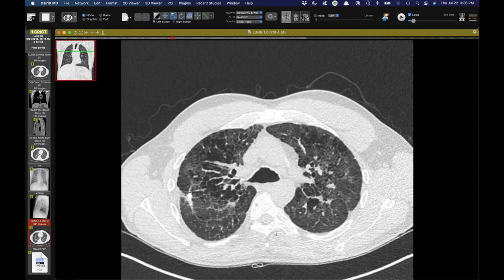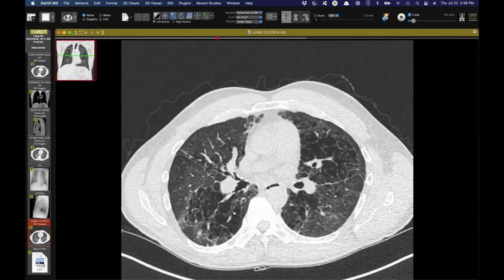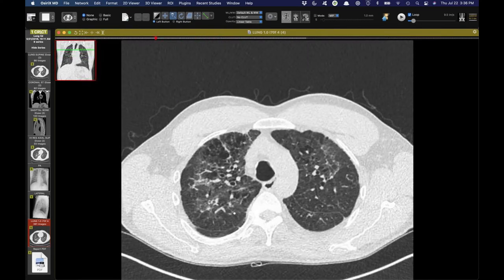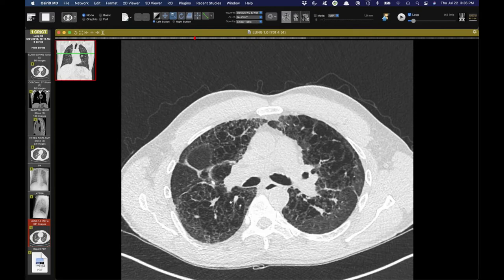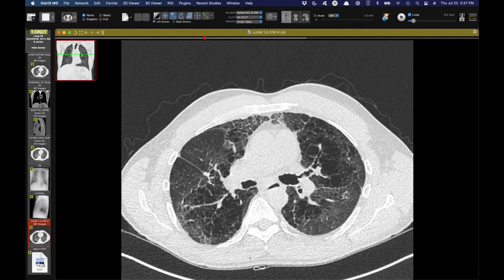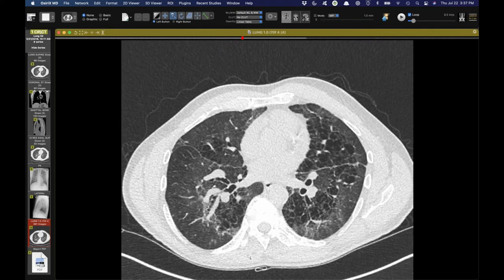Could be like a weird burned out sarcoid, given the distribution. Yeah. Well, that's why I was first thinking like some sort of exposure or pneumoconiosis, even though you don't have the conglomerate fibrosis with that distribution. Amyloid, does anyone think of amyloid? No signs or symptoms of connective tissue disease. That seems to be no. Unclassifiable diseases.